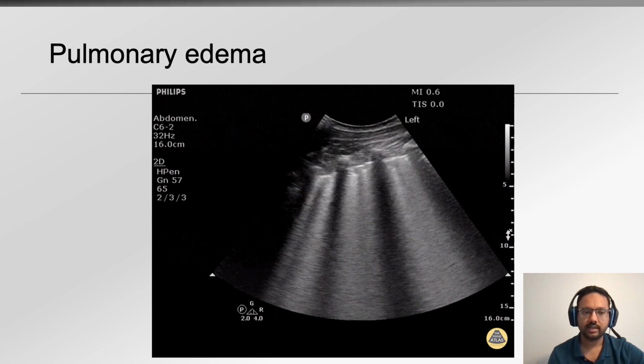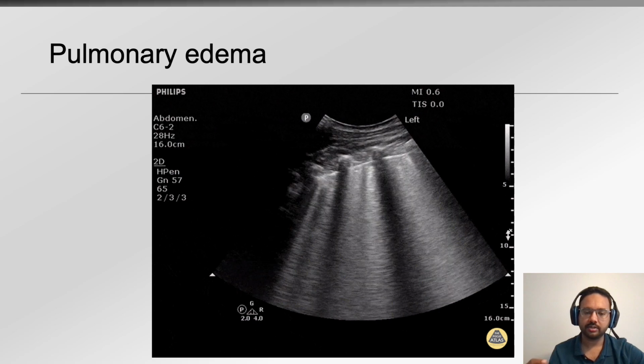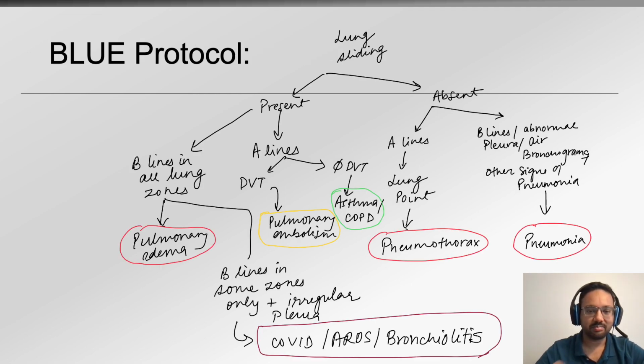In that case, thinking through one particular diagnosis at a time is not helpful. Putting it all together is helpful. So this is exactly what I want to do. I do want to apologize for this messy scribbling, because instead of putting it together on a presentation, I thought it would be much more helpful for me to write my thought process on a piece of paper.